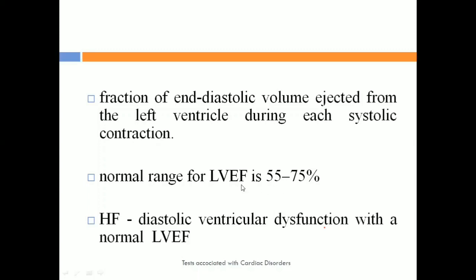Generally, the normal range of left ventricular ejection fraction is 55 to 75%. At the same time, the patient might be having the left ventricular ejection fraction in this range, but still the patient might be having the heart failure because of diastolic ventricular dysfunction, again, right?